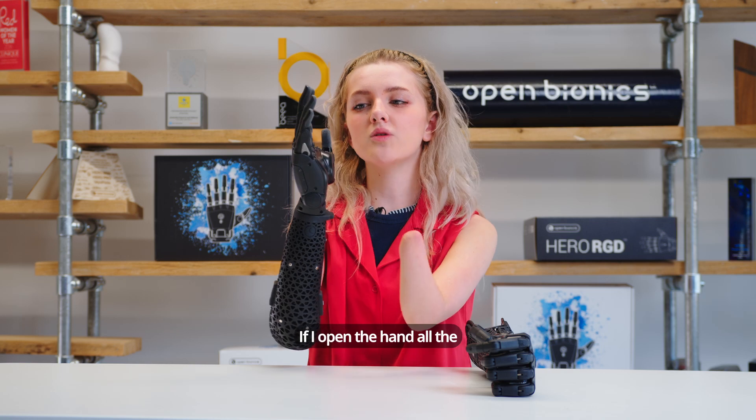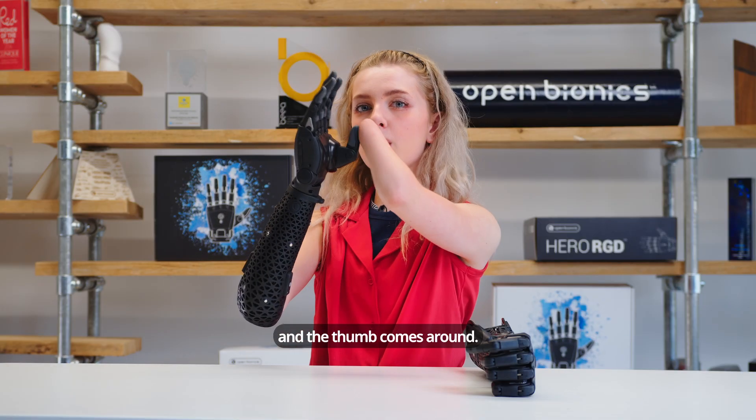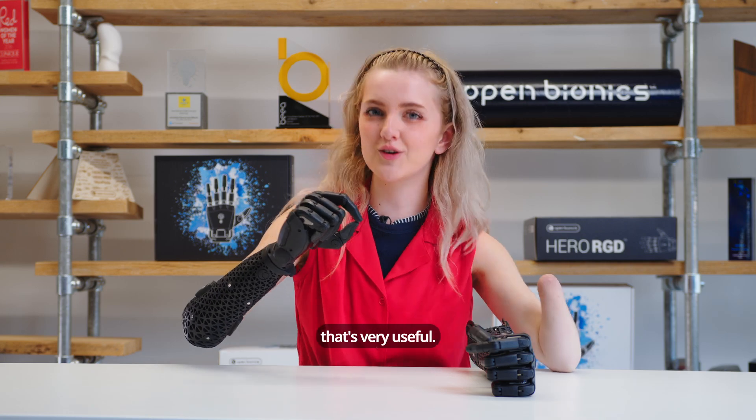If I open the hand all the way and try to open some more, the button on the back will flash green and the thumb comes around. This is our second grip mode, which is just a standard close like that — if you were to hold a cup or something, that's very useful.